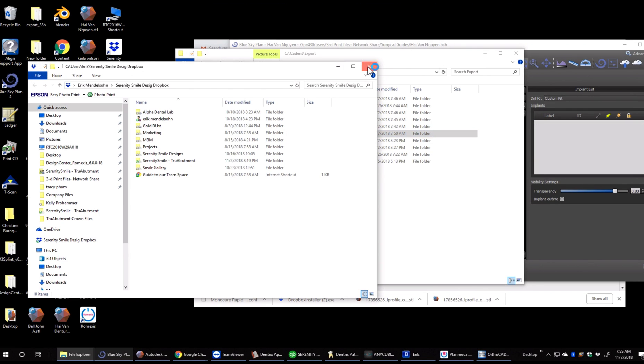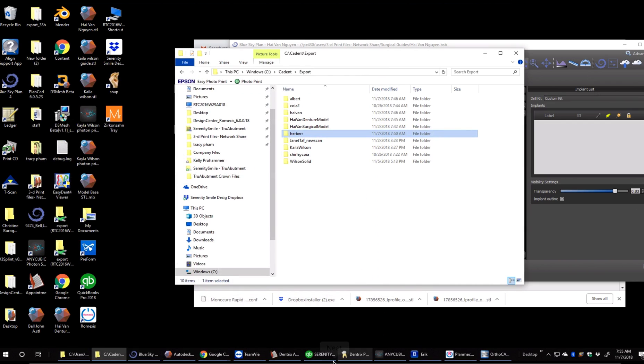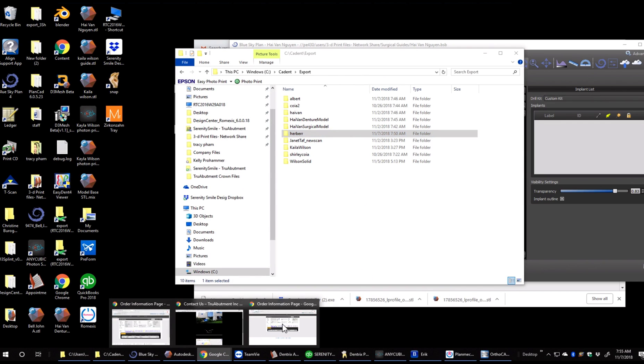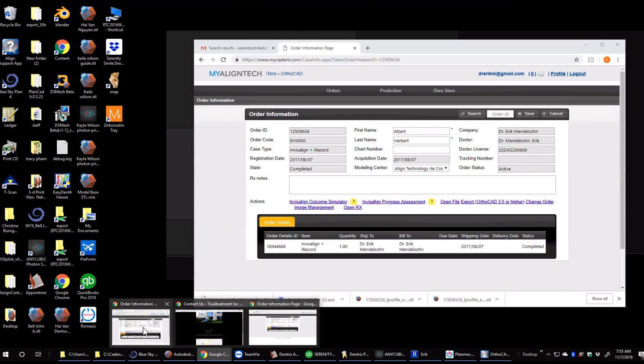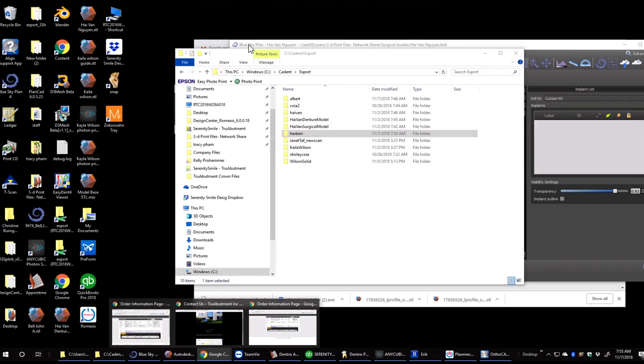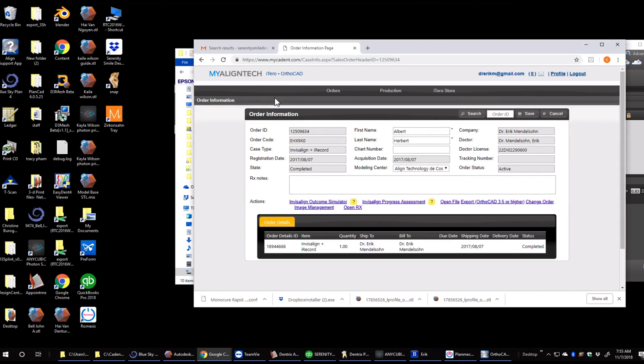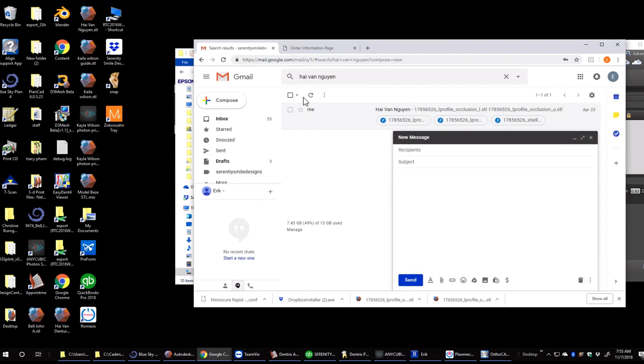If we were to go ahead and want to email that file, we would just go ahead and open our email. Click on compose.